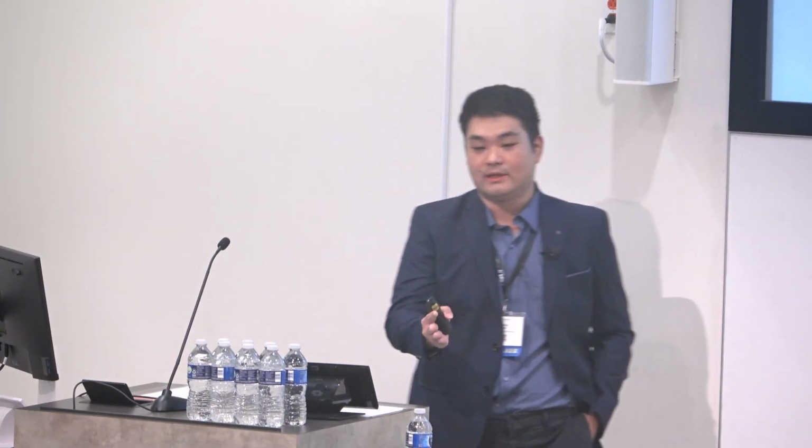And this workflow, if you apply it to a new clinic, because different clinics have different protocols, if you have a pre-trained AI model, you need an additional 4 or 5 patients in this clinic, then they can fine-tune it into a new AI model for your specific clinic. But if you're doing it a statistical way, then you need an additional 100 historical patients to predict what it looks like. Okay, thank you.